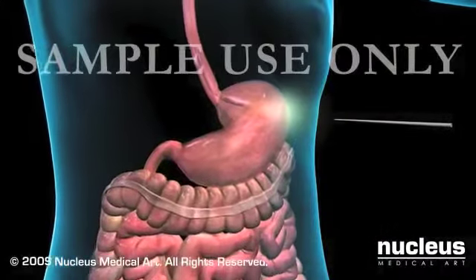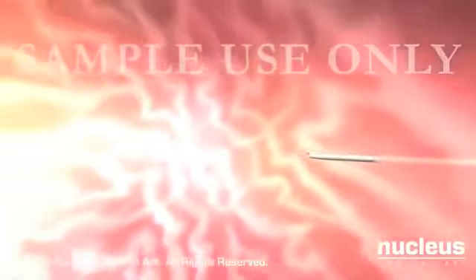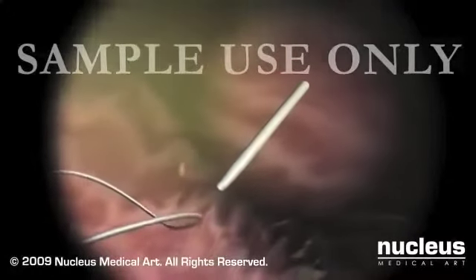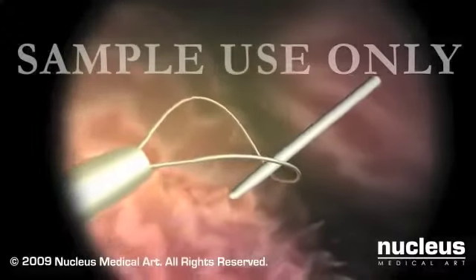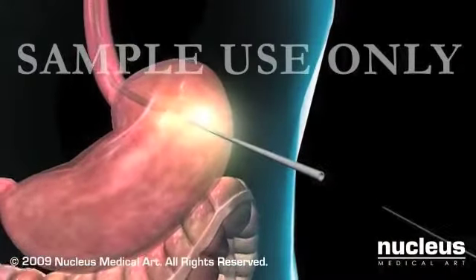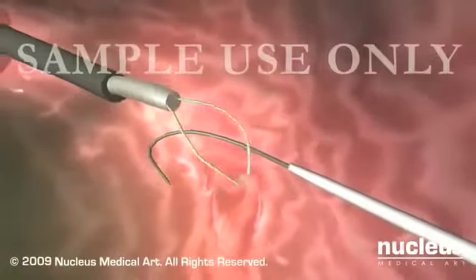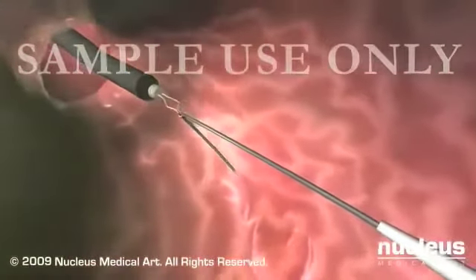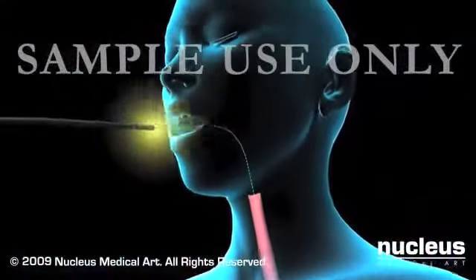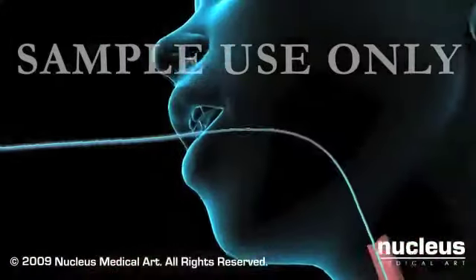Next, your doctor will insert a needle through your skin into your stomach at the location where the PEG tube is to be placed. While doing this, he or she will use the endoscope to locate the end of the needle inside your stomach and encircle it with a wire snare. Your doctor will then pass a thin wire through this needle into your stomach, attach the endoscope to the wire, and pull both the endoscope and wire out through your mouth. At this point, there will be a thin wire entering the front of your abdomen into your stomach and continuing upward and out of your mouth.